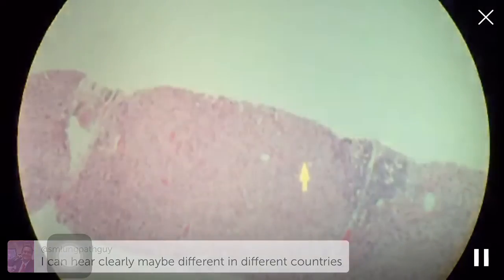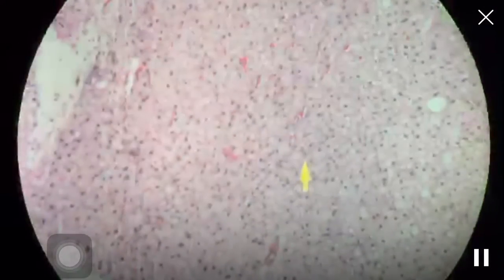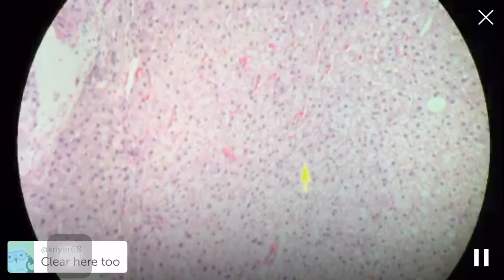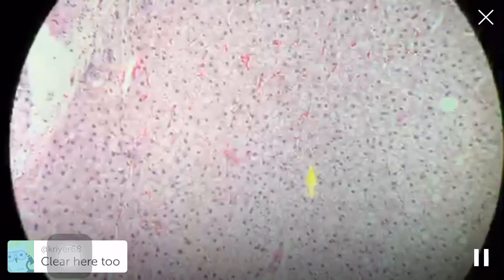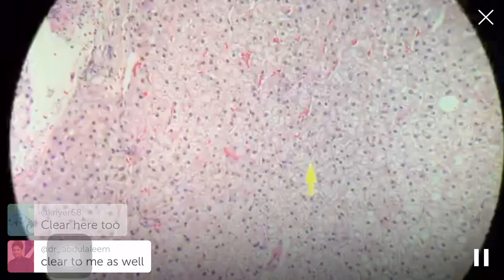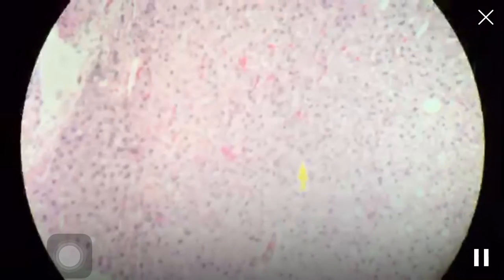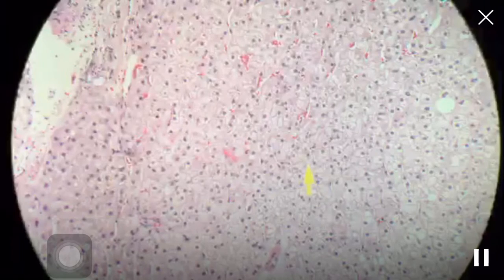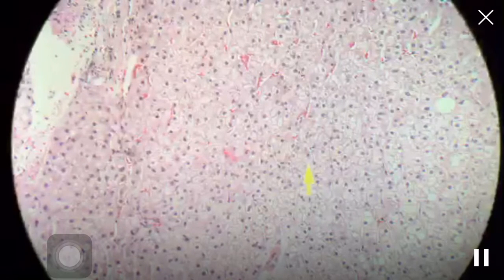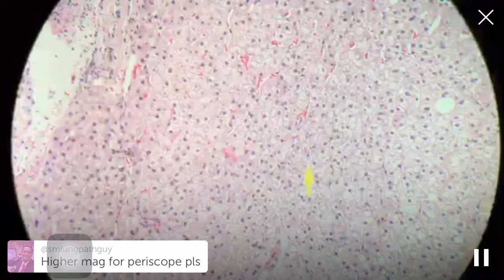So, the next thing I look at, so this has mild steatosis. The next thing I look for is steatohepatitis. And the classic forms of steatohepatitis are hepatocyte ballooning with Mallory-Denk bodies. So here's another digression. We used to call them Mallory bodies. Now we call them Mallory-Denk bodies because Helmut Denk in Austria, in Graz, did a tremendous amount of work studying the intermediate filaments that create them and the lesions themselves.